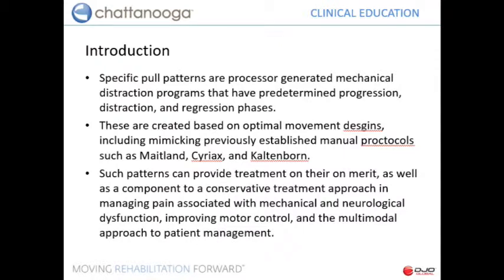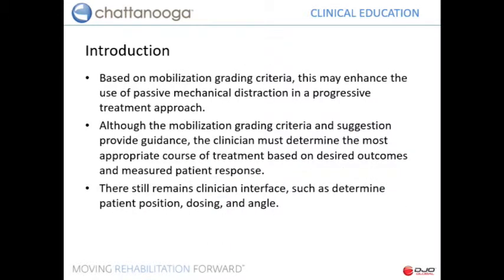With today's devices, we have an opportunity to mimic some of these manual therapy protocols, whether it is a distraction, or in the case of spinal, an axial distraction, that we can correspond to mobilization grading, such as Maitland and Cyriax and Kaltenborn's. And so we use the same interpretation as to why we would use different patterns, whether static or different types of hold patterns, intermittent or cycling.